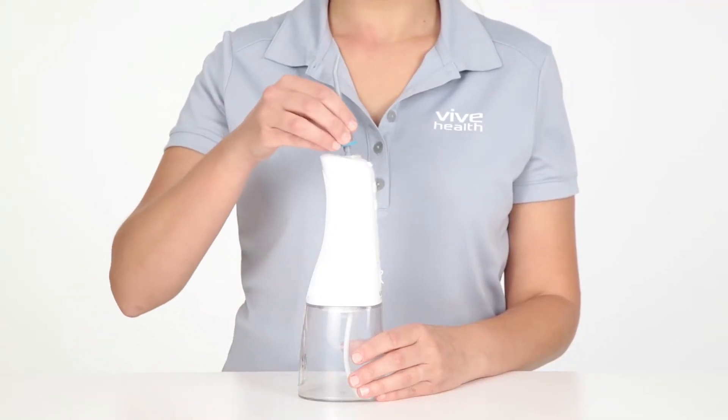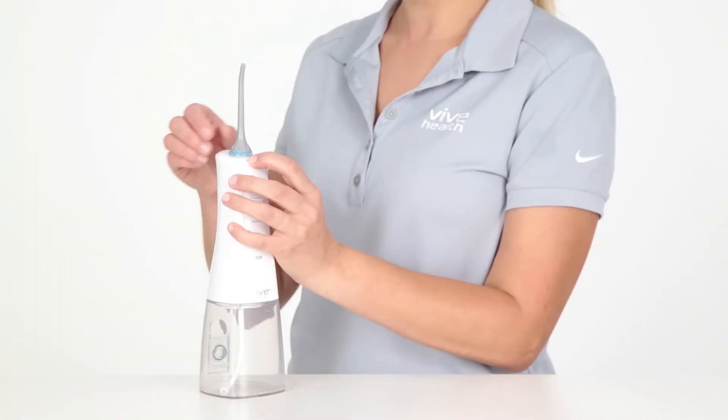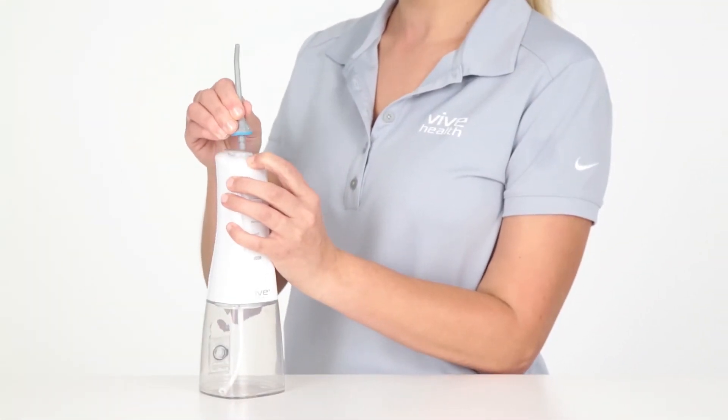Insert the tip into the spray head hole by pushing it in until you hear a clicking sound. To change or remove the tip, press on the removal button before removing the tip.